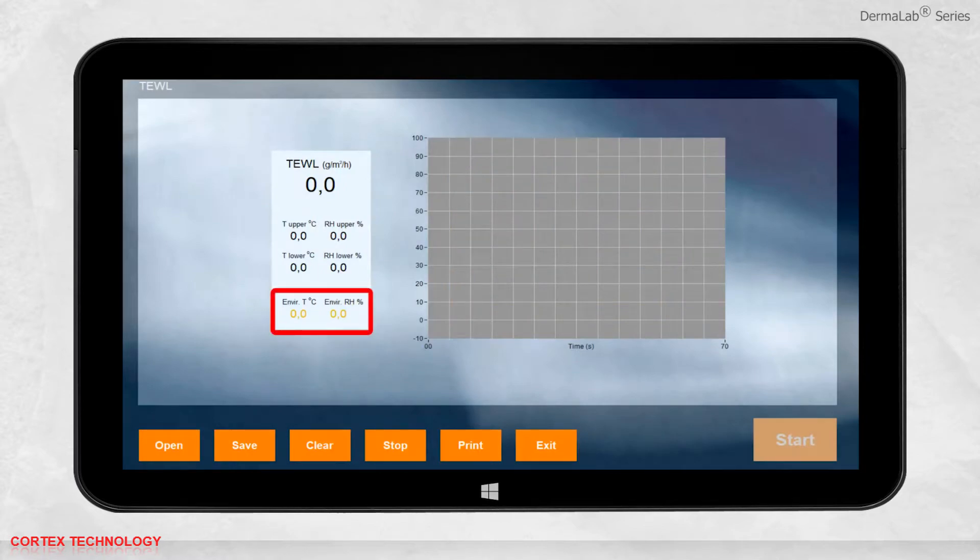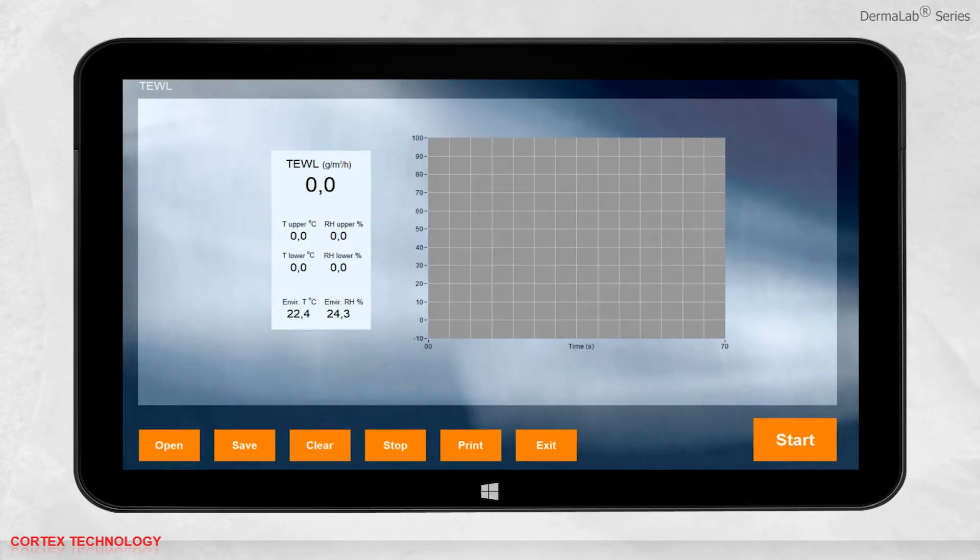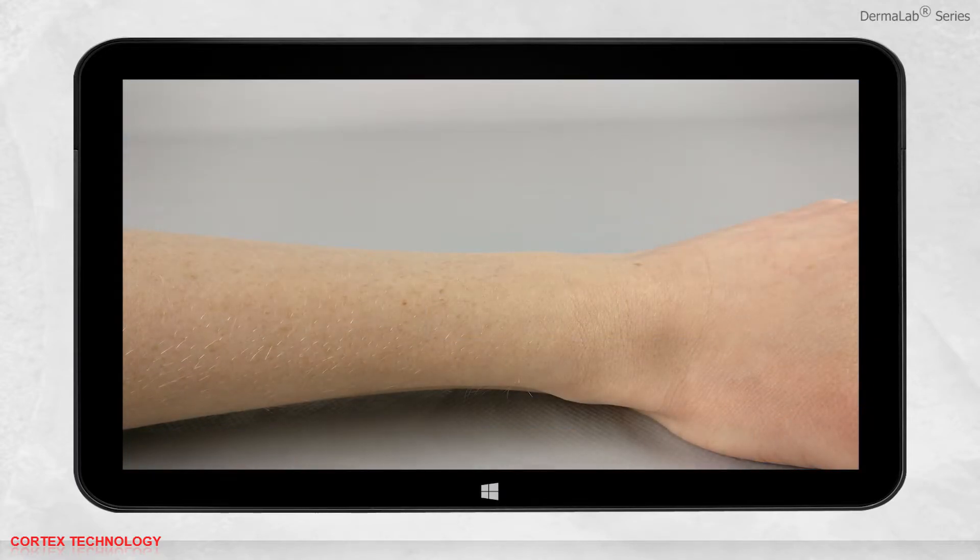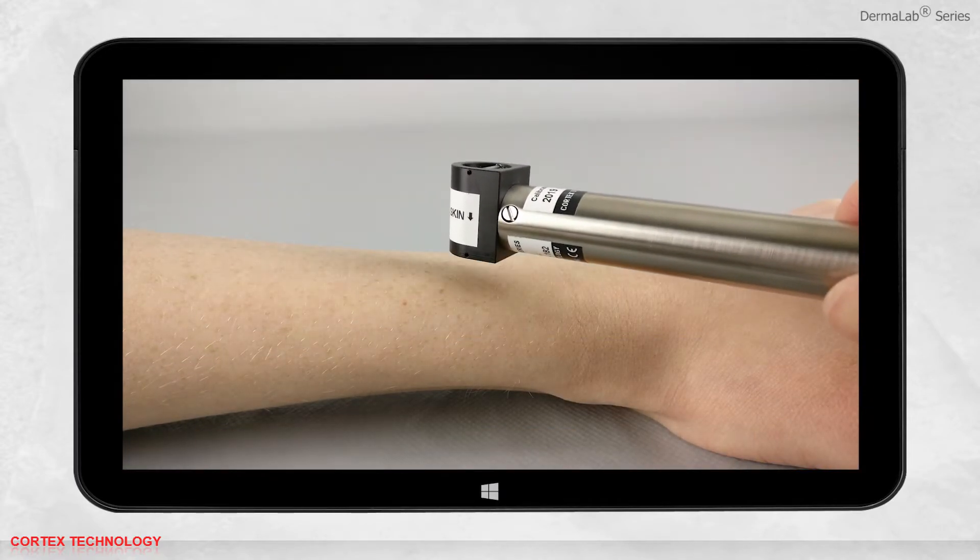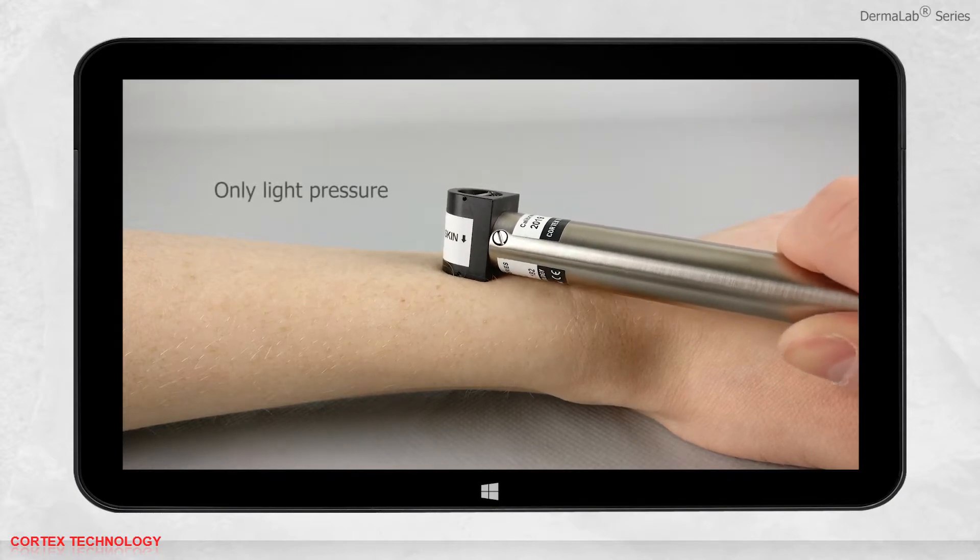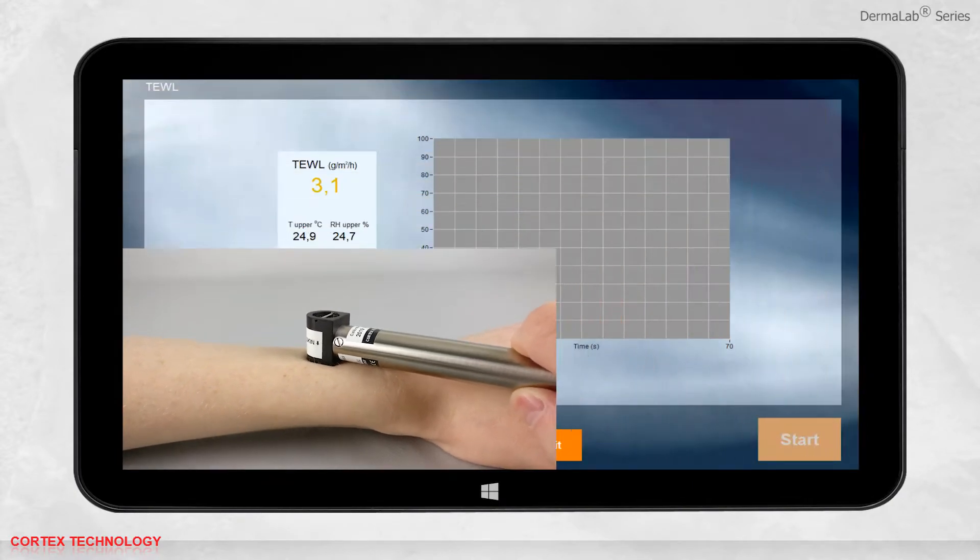Upon entry, the environmental temperature and relative humidity is calculated. Now you are ready to perform a measurement. Place the probe where the measurement should be performed, applying only light pressure, and press start.